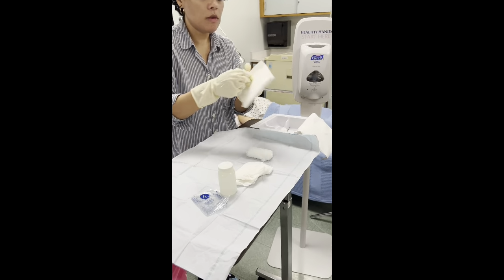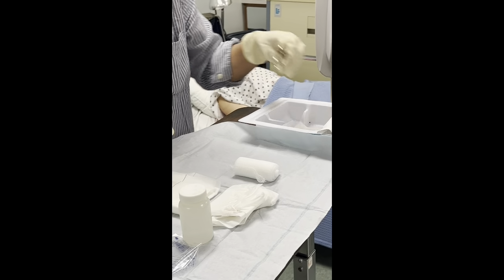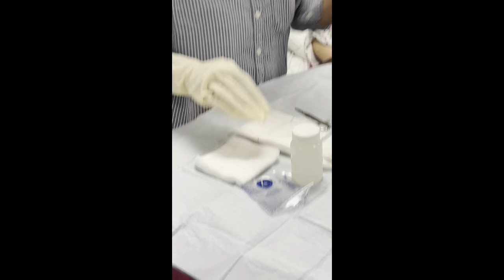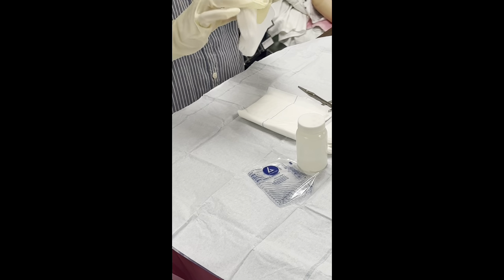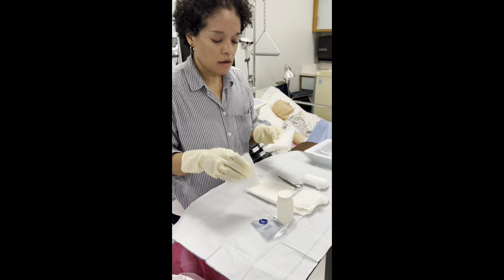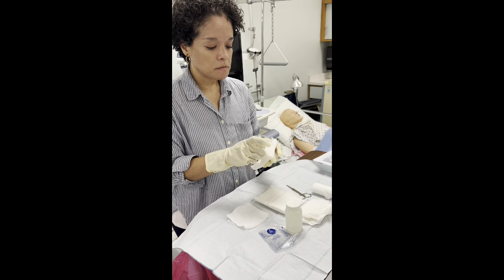Okay. Here is the dressing pad, forceps, 4x4 gauze. And how many are there? About 6, I think. There are about 6 in which we're going to separate 3. Yes. So each of the 3 separated gauze will be for cleaning the site. Excellent.